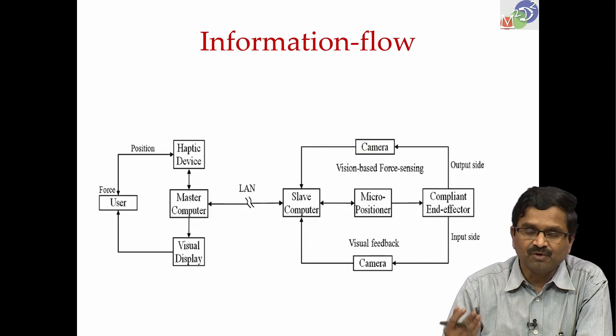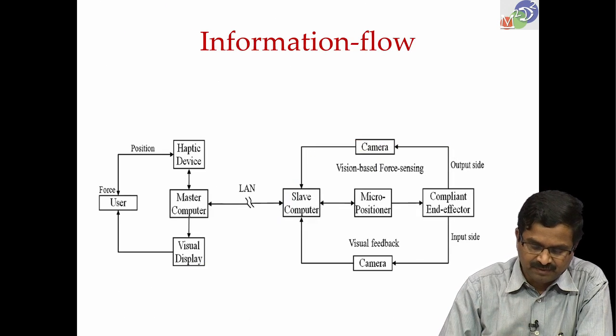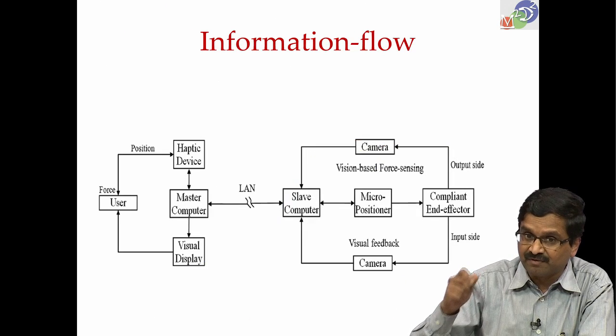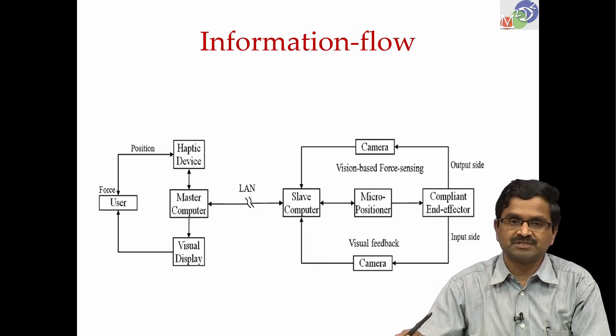This was the information flow when you do teleoperation. So, we said at the beginning that you can also do teleoperation, now that we have a safe device which cannot exert more force than needed.